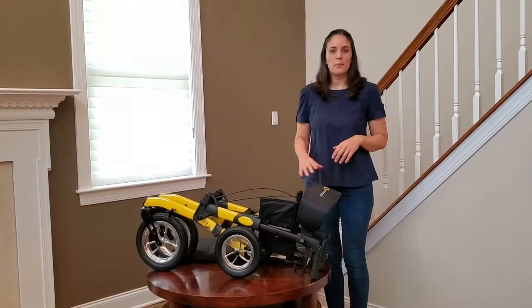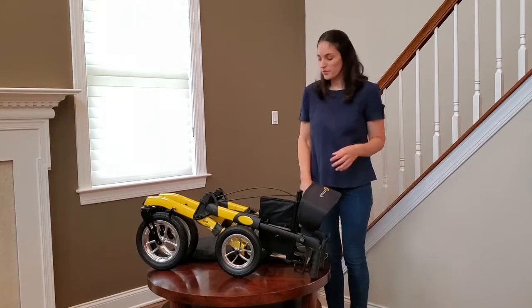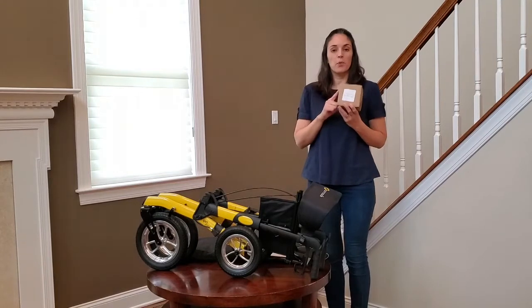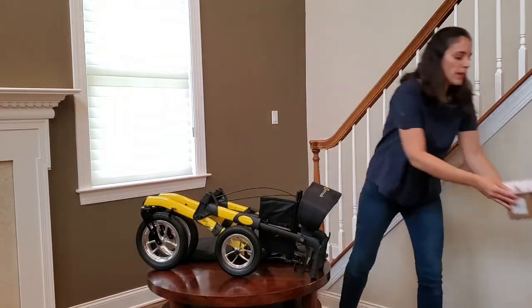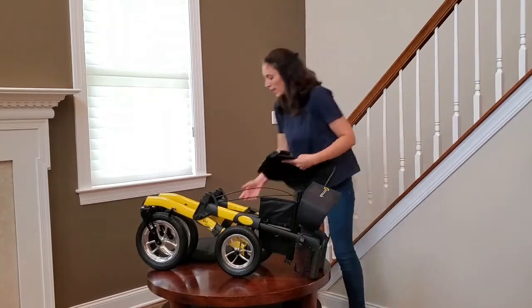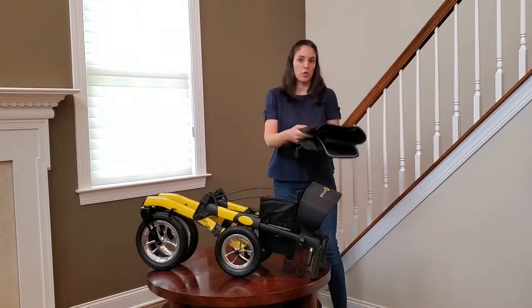Today I'm going to show you how to assemble your Komodira Tipo Alture. In the box you're going to find the walker itself, a little box with the Komodira cup holder and cane holder, your user guide, the shopping bag, and the transport bag, which you're going to use to carry your walker around.